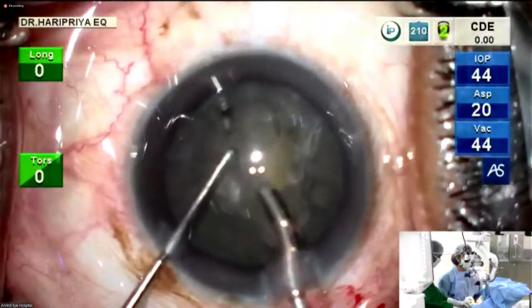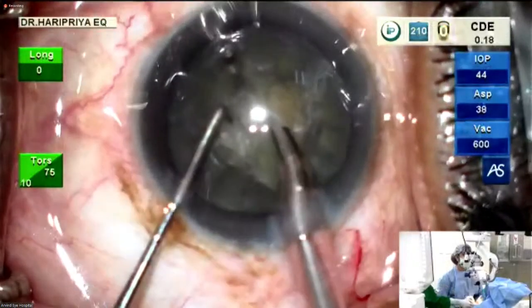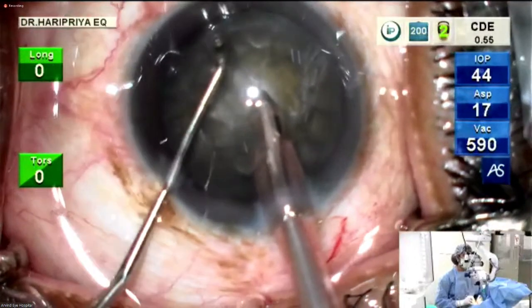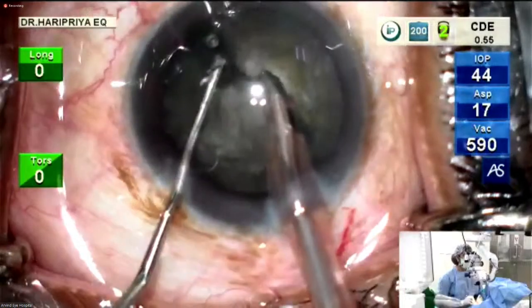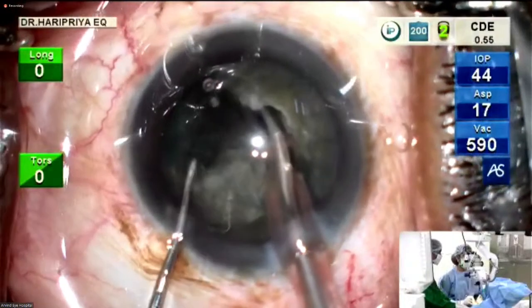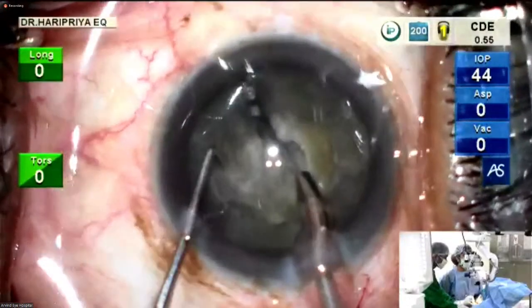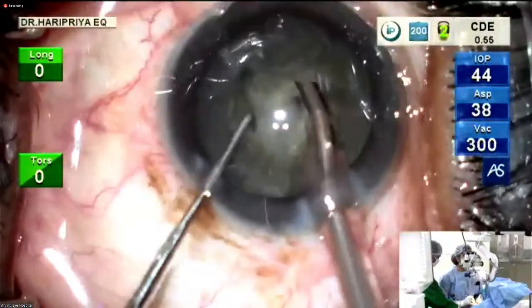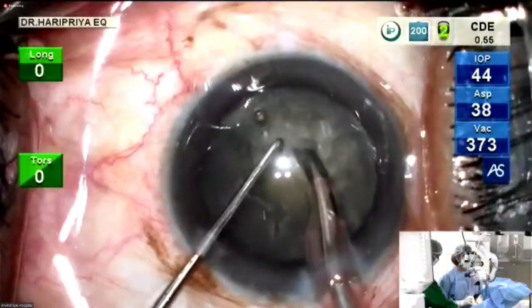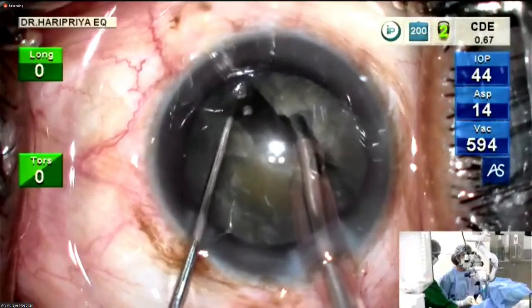In a vertical chop, which is what I'll be doing in this hard cataract, I normally start with a little burrow in the center, and then I go in completely, occlude, and then do the vertical chop. Then you'll probably have to continue to hold and place the chopper a little deeper if required, and wait to see if your posterior fibers have broken completely all the way to the center. You can either re-occlude the tip, or continue to hold with vacuum and replace the chopper again. I will ensure I complete the first chop, place the lower half chopper, and separate. So wait patiently and separate.